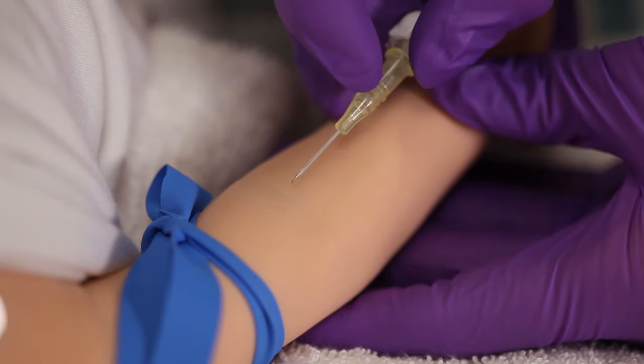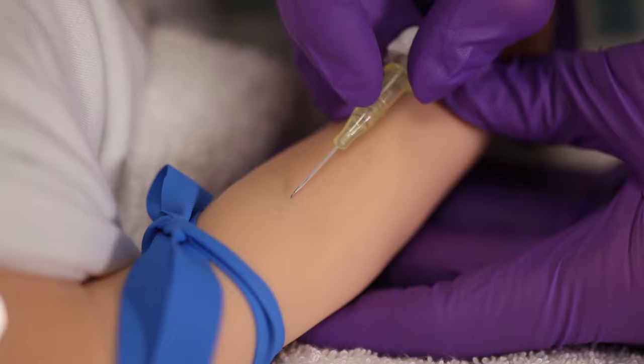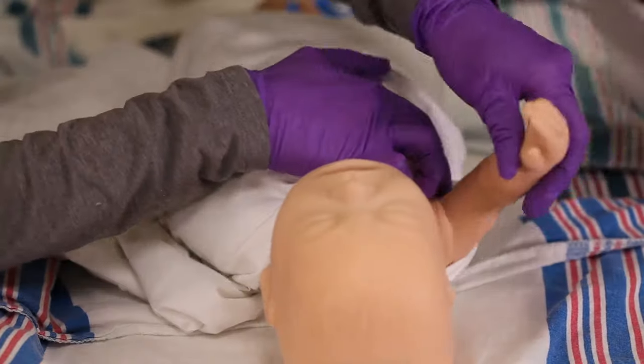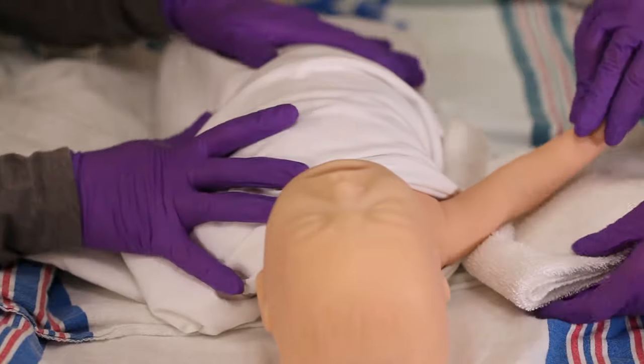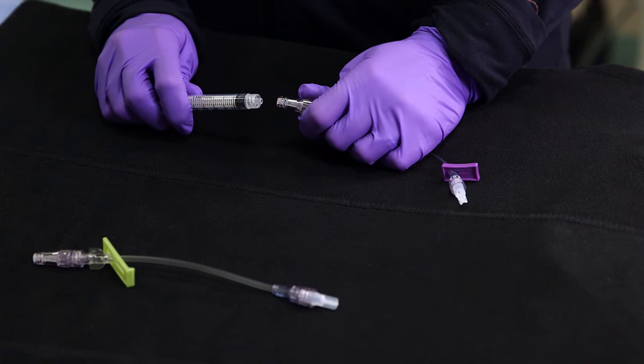Remember that the vein in an infant is likely to be more superficial than it would be in an adult. The angle is more shallow, which could affect the way you hold the extremity. A tip for getting just the right angle: try placing a towel under the elbow.